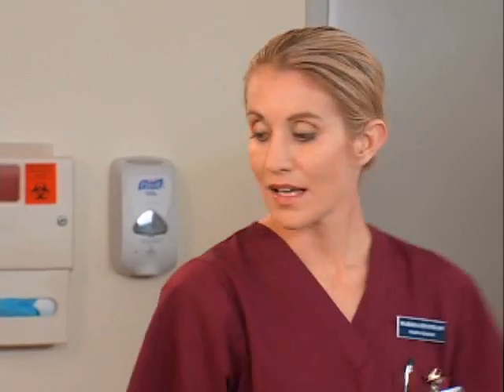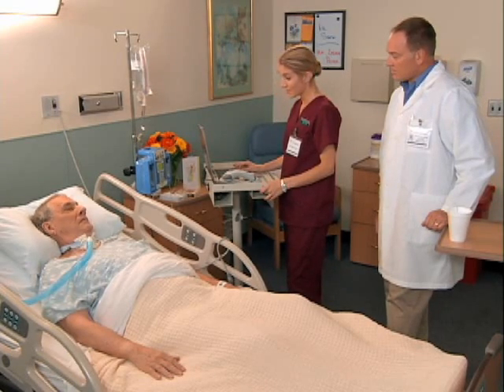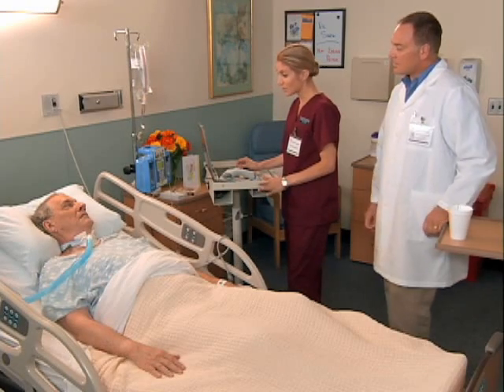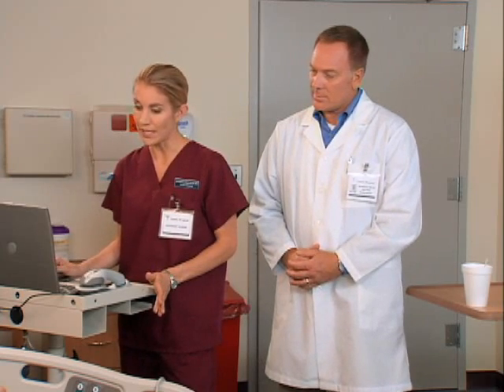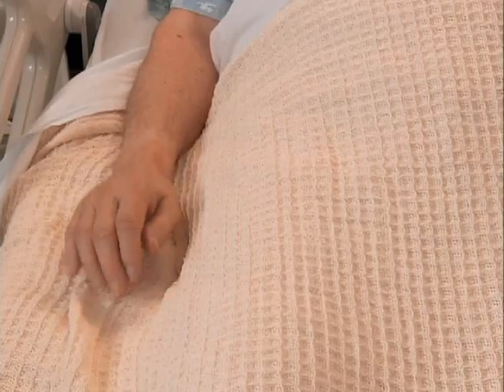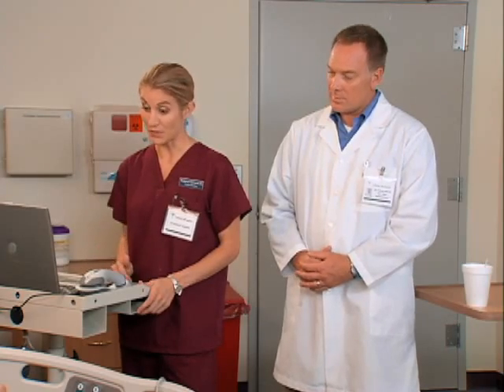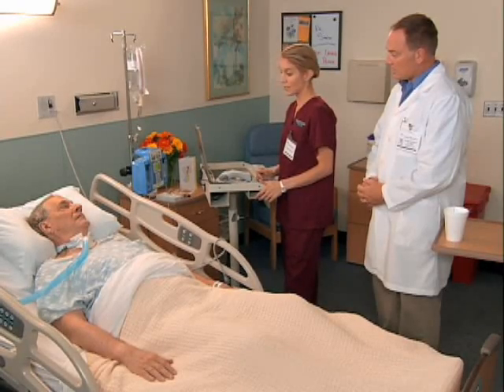Right. I'm going to start by changing the inside part of the tracheostomy, then the dressing on your neck, and the collar that holds it in place, okay? Now I'll make sure to announce each of my actions aloud so you know what I'm doing. If at any time you have pain or feel bad in any way, signal me and I'll stop right away. Now let's agree on a signal. How about if you make your right hand into a fist and raise it slightly in the air like this? Can you do that for me? Great, so you understand that signal from you means I should stop what I'm doing. Okay, in addition to any pain, you should let me know if you're having any difficulty breathing.